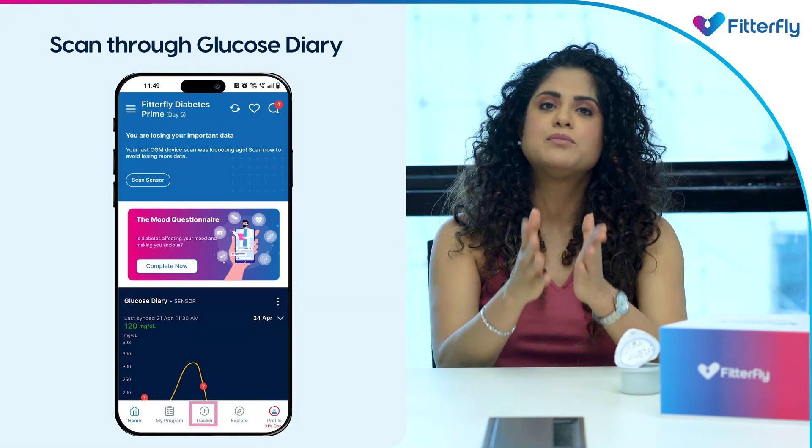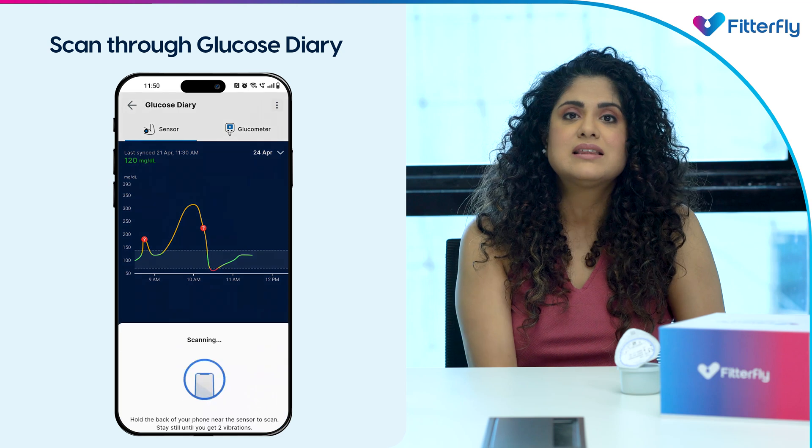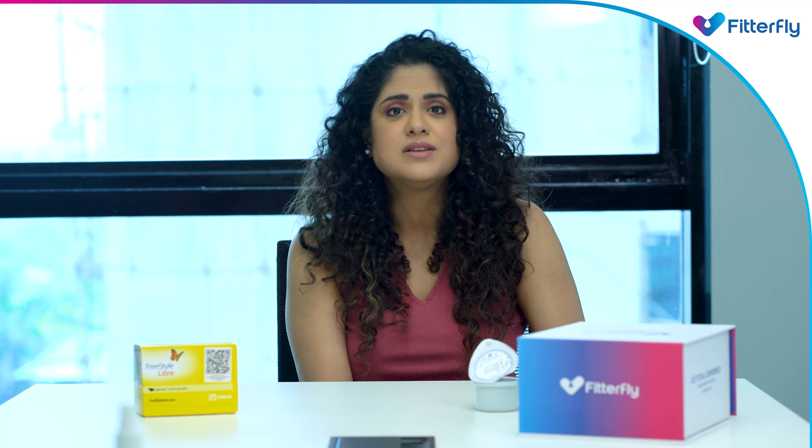You can also scan from the Glucose Diary in the Tracker section under the Sensor tab. Click the Scan button on the bottom of the page to scan your sensor.